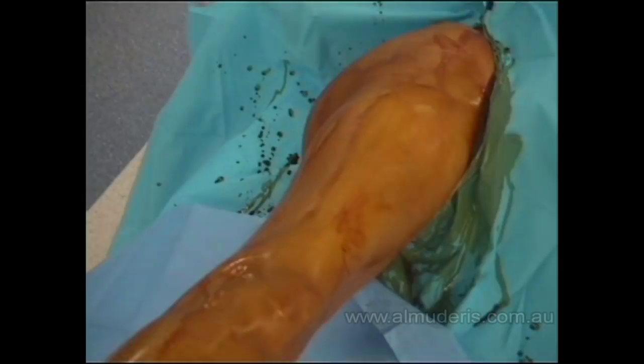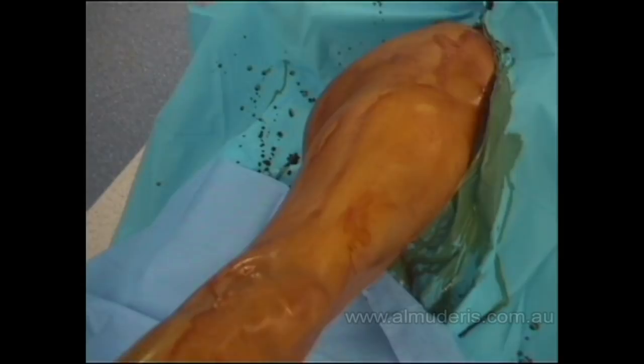The patient is positioned on the operating table in the lateral position. The patient position is secured using side supports. Patient draping is done using sterile extremity drapes and the skin should be completely isolated after draping.